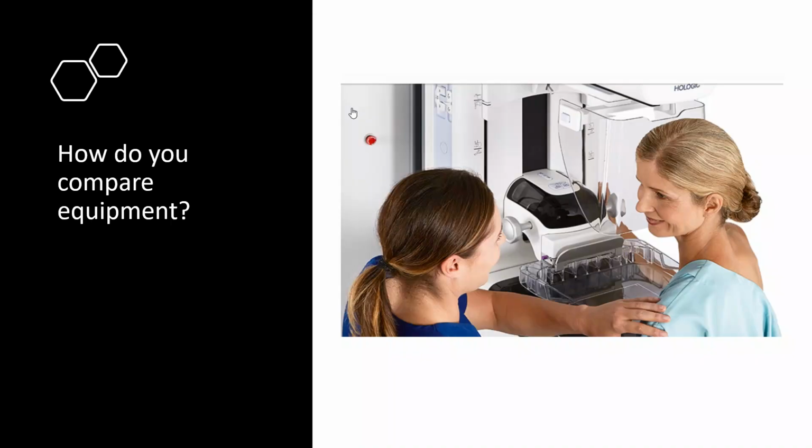After seeing all of the documentation on how the components work, how do you compare your mammography equipment against other mammography equipment, and what do you think you'll look for in the future?